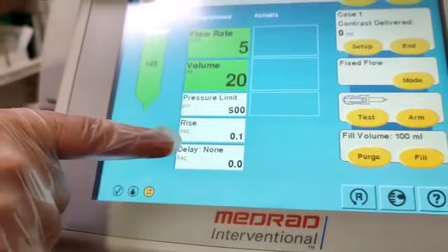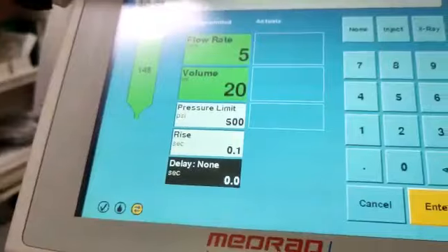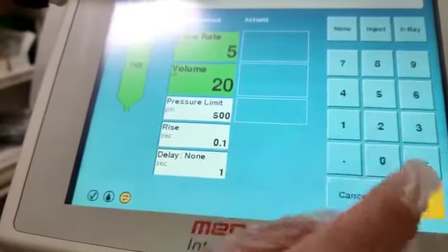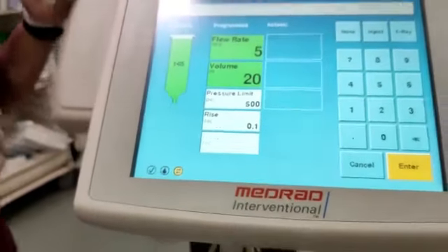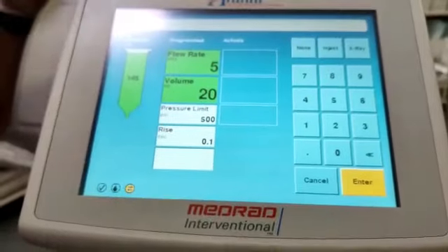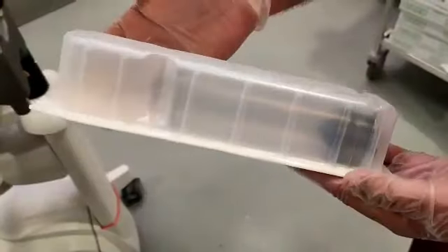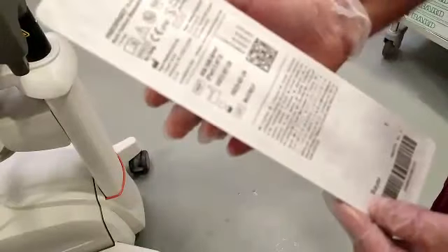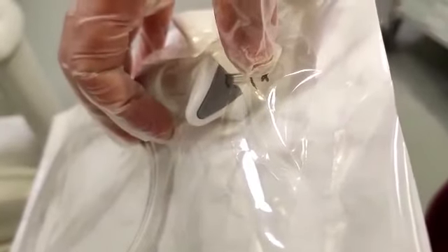There is also an X-ray delay parameter — for example, if I set a delay of one second, the injector will wait one second after the X-ray starts before beginning the injection, as per your set parameters. The disposable items for this injector include the injector syringe and the hand controller. The hand controller has one button for contrast injection and another for saline flush. This is the port where you connect the hand controller.